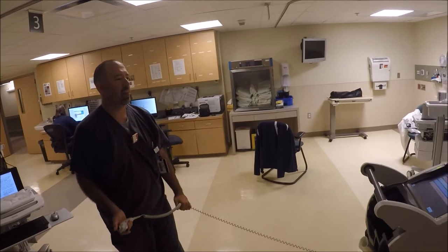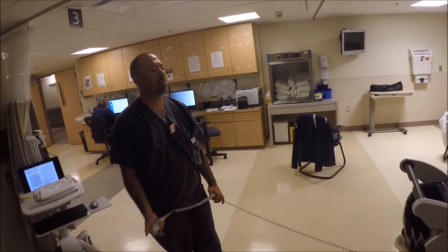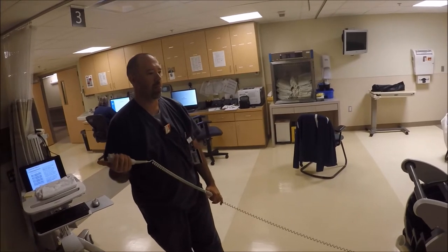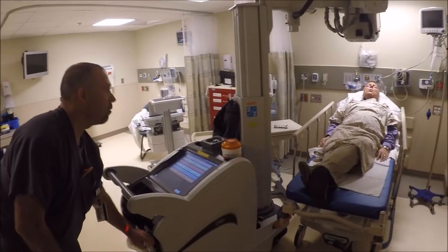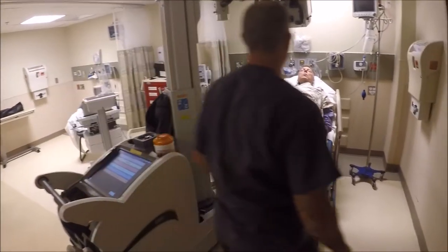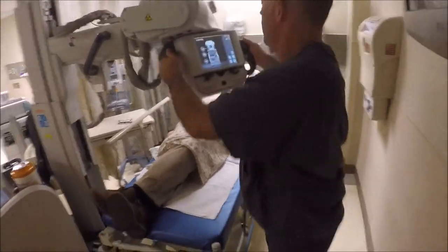Now go ahead and take in a breath. Let that breath out. And take another deep breath in and hold. Go ahead and breathe and relax. We're all finished. We'll get that X-ray tube out of the way and then we'll get that board out of there. You did great. Looks like we've got a great image.